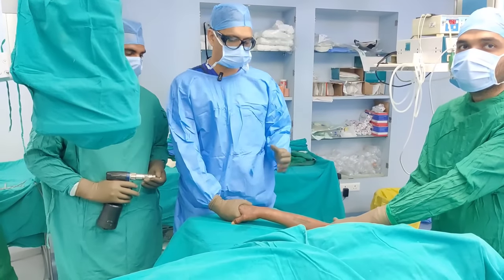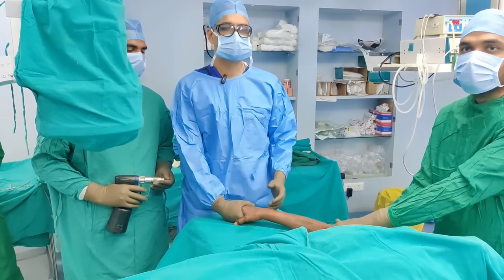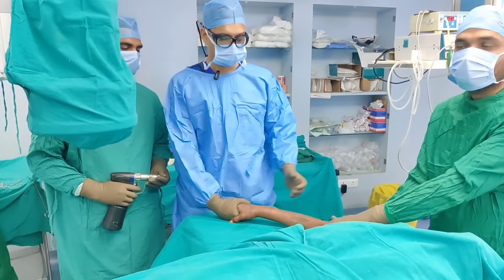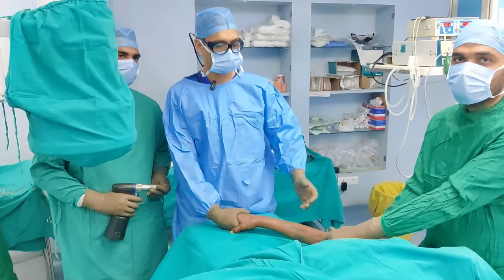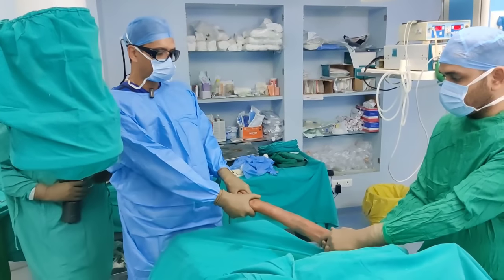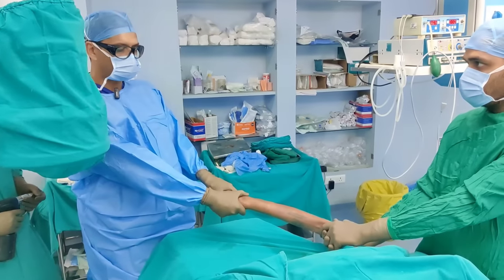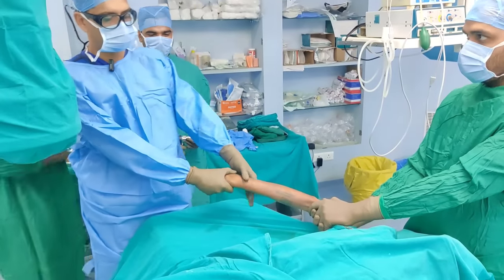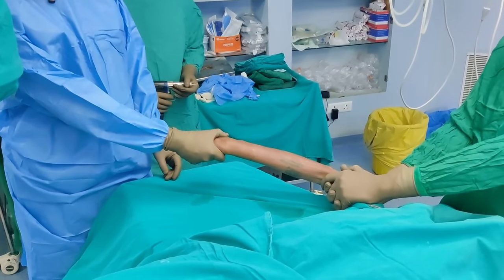The first thing is satisfactory reduction of the fracture. Unless you reduce it in a satisfactory position, you will not be able to fix it in a satisfactory position. Traction and counter-traction — I cannot emphasize this enough. I do it for every case. Pramod gives counter-traction and I give traction, and you need to give at least 3 to 5 minutes — 3 minutes usually does the job. This will get your radial length good, and then for volar angulation you just need to do palmar flexion.